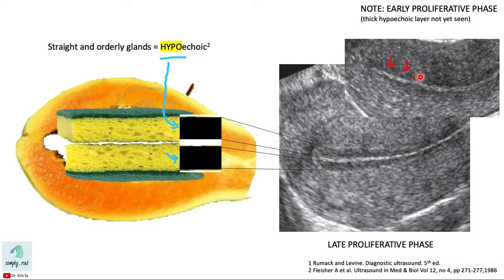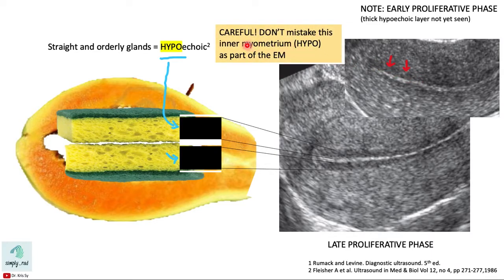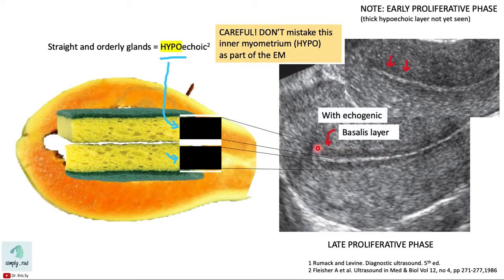What is this hypoechoic layer? This hypoechoic layer is actually part of the inner myometrium. We have to be careful not to include this when we take the endometrial thickness. To differentiate this inner myometrium from the hypoechoic functional layer, we look at the basalis layer. In the true trilaminar appearance, we see the echogenic basalis layer lining the thick hypoechoic functional layer. This basalis layer is not seen at the inner myometrium portion.